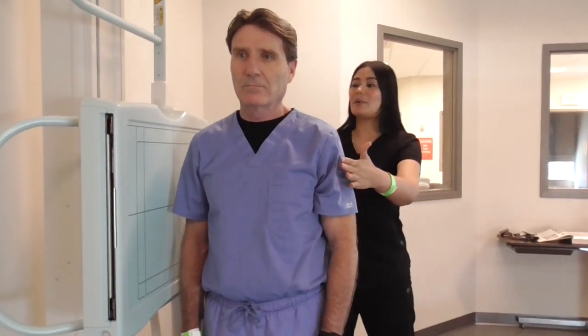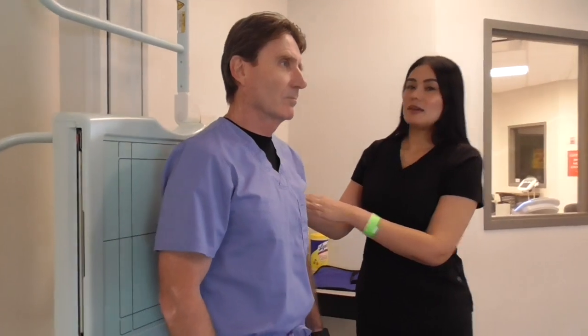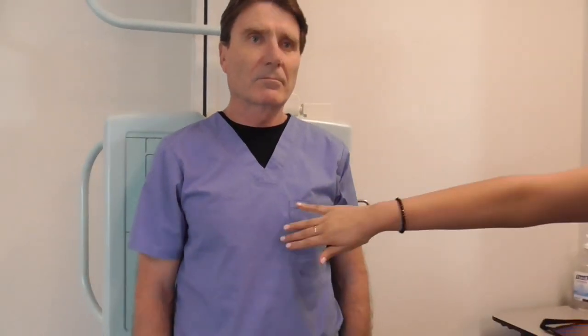I'll now be demonstrating an AP projection. I'm going to have his back closest to the IR, so the X-ray beam would be going anterior to posterior. This is an AP projection.